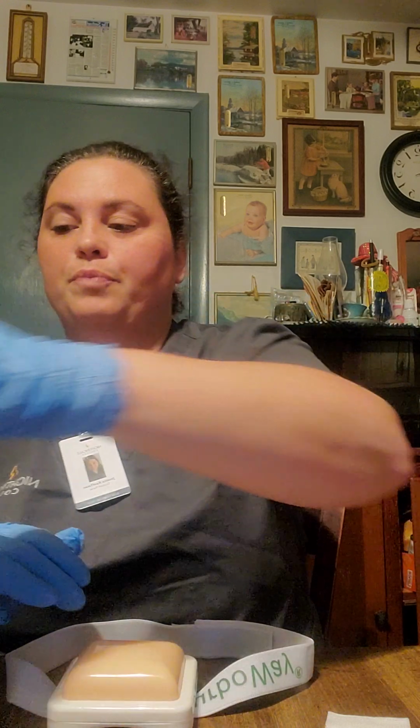I then would palpate the area to make sure there's not any masses. Okay, and I would clean the area from the inside out. Okay, I'd dispose of this. Alright, since I capped my needle, I would let my alcohol dry first. Since I capped my needle, I'm gonna have to uncap my needle here.